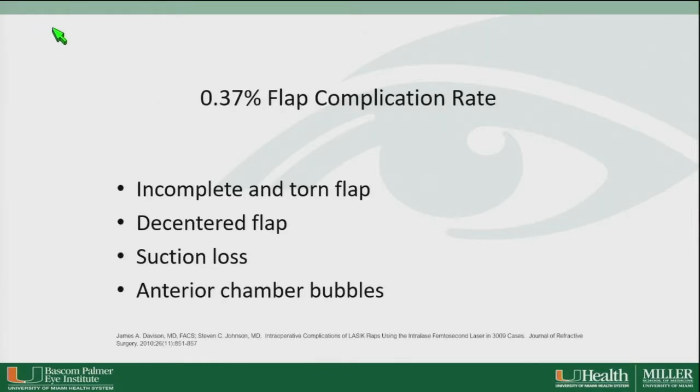So LASIK remains one of the most common corneal refractive surgeries that is currently performed, and fortunately the complication rate is quite low. But complications do occur. The published complication rate of femtosecond LASIK flaps is 0.37%, and for the sake of time, I'll just be talking about intraoperative flap complications and how to manage them.